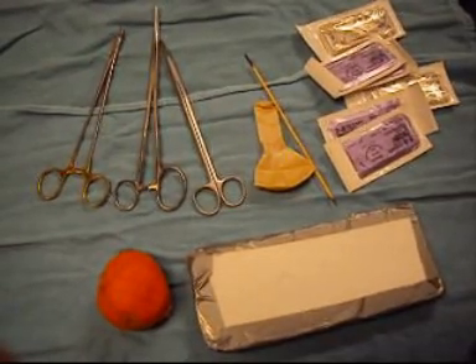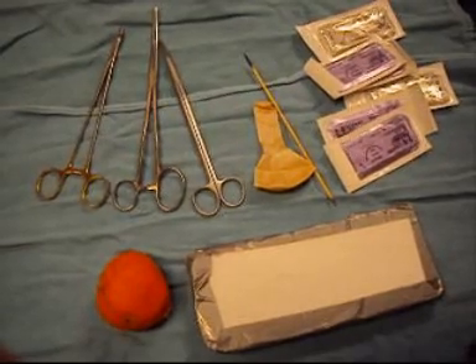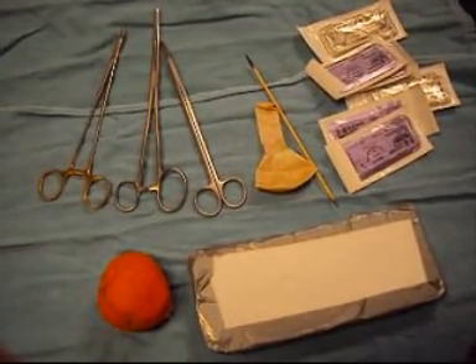You will also need a needle driver, Metzenbaum scissors, a party balloon, a skewer, and some suture material.